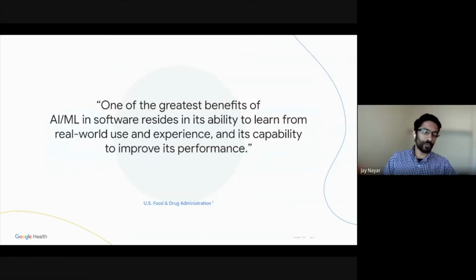Okay, so starting off, why do we need to monitor? The best endorsement for the need for AI monitoring in healthcare is a quote from the FDA itself, presented on screen. In October, real-world monitoring was recognized by the FDA, the MHRA, and by Health Canada as a guiding principle of good machine learning practice for medical device development. This identifies and clearly requires the development of novel ways to effectively monitor real-world performance of regulated healthcare AI.